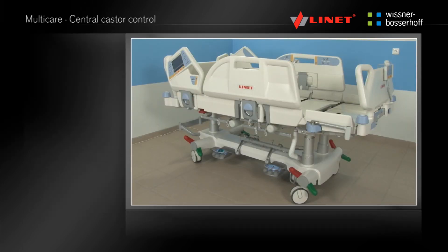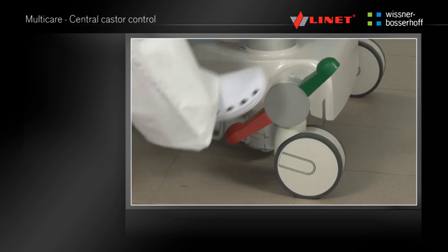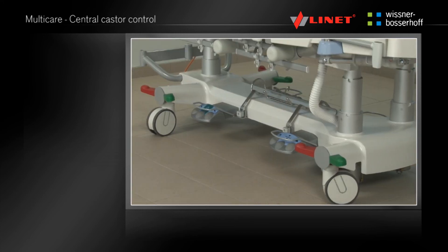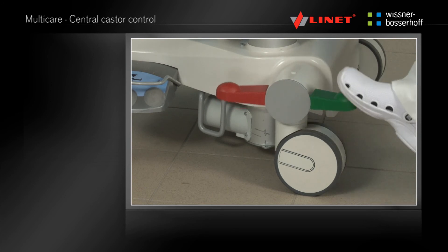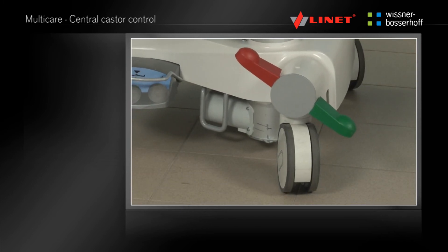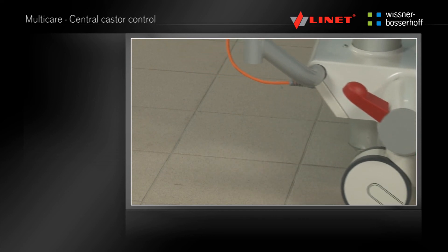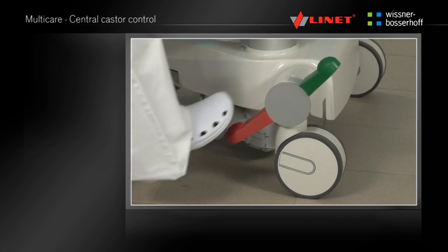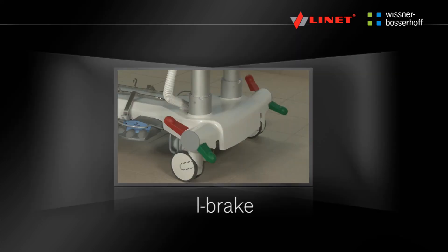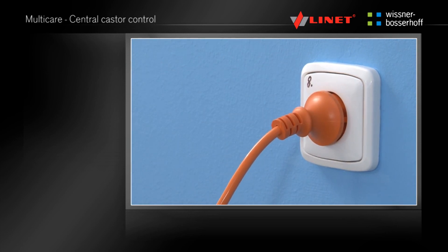The central caster control lever is located at the foot end on both sides of the undercarriage of the bed. If the lever is in the horizontal position all casters will be unbraked. If the red end of the lever is up, the fifth caster will be activated — this function makes transportation easier. If the red end of the lever is down, the bed will be braked. The automatic bed braking system is activated after one minute if the bed is connected to mains electricity.